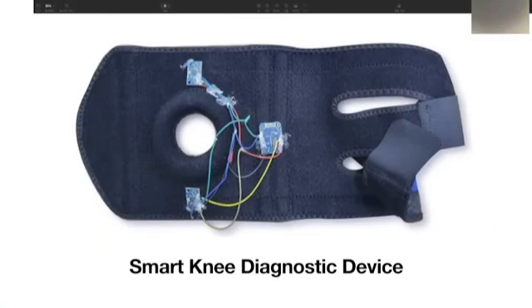A traditional method for measuring knee range of motion is by using a goniometer, which is a specifically designed protractor that measures joint angles. This project attempted to develop an automated device using simple hardware from the Arduino Enhanced device and a laptop that could calculate the knee range of motion of people.